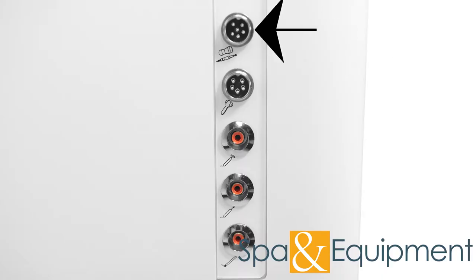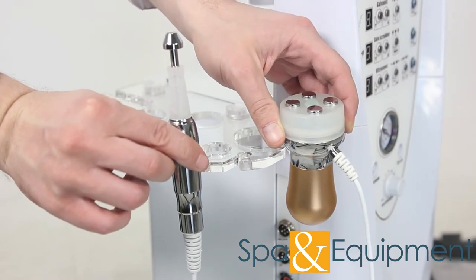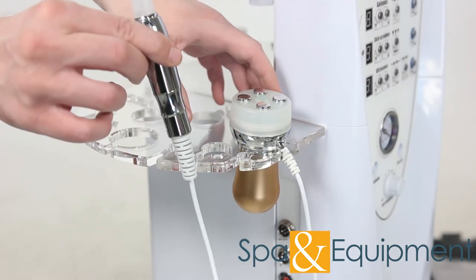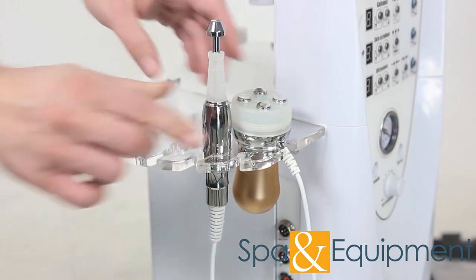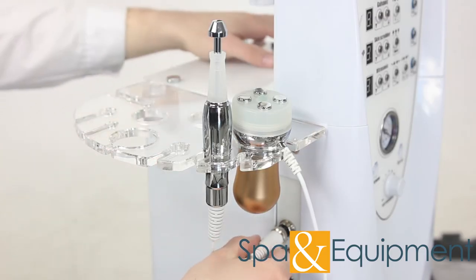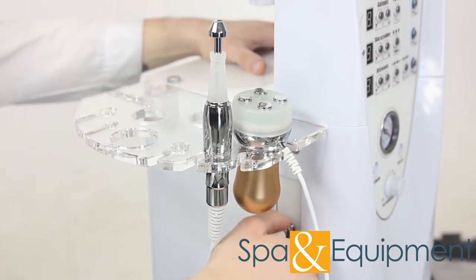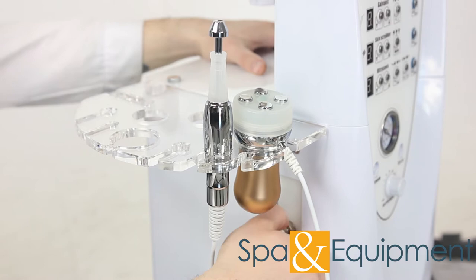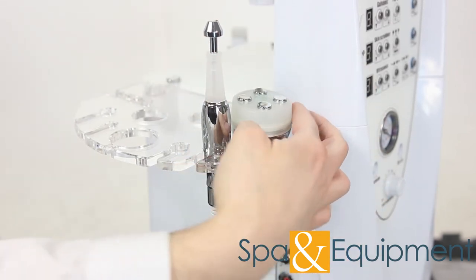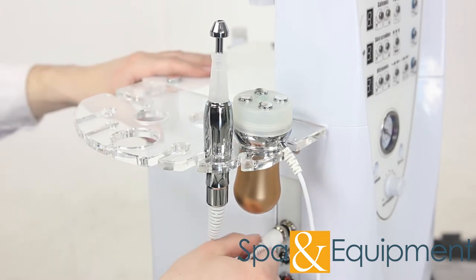We'll start with the tool whose plug is on top — this one is for the needleless mesotherapy handles. Please note, many of the plugs on the cables look like this. Make sure the top arrow on the plug is on top when you insert the plug into the machine. Once the plug is inserted, you can screw on the lock to secure it in place. It's important to note that both of the mesotherapy handles share the same socket. When you're done with one and you want to use the other, unplug the one you are using and plug in the other one.